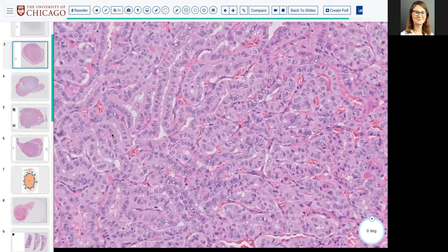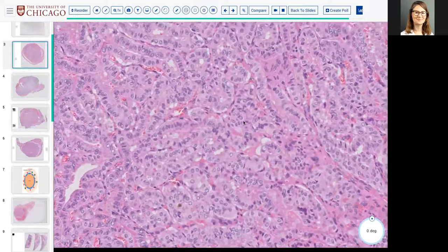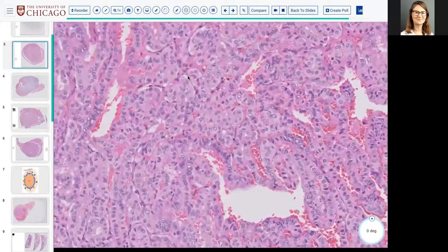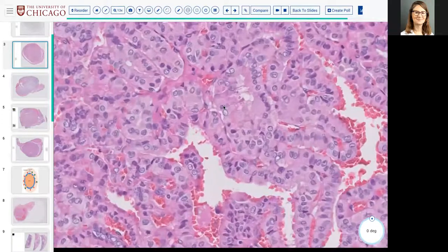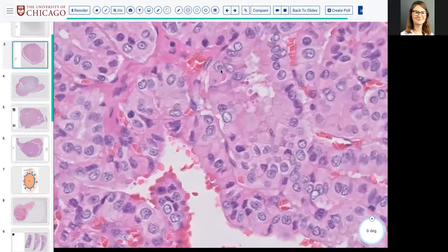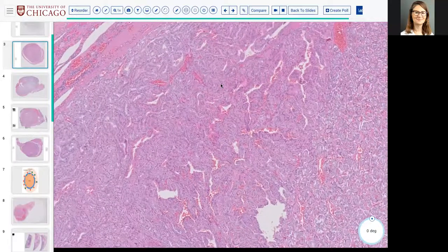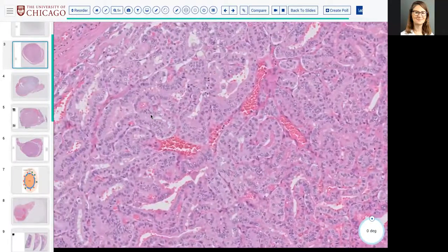There's a papilla right there, and potentially some intranuclear pseudo-inclusions, but I'm not going to go searching for them. You'll be able to do that when I give you the slides. No, maybe there's like the start of one right there. I see. So this was confirmed to be positive with genetics, with sequencing. So this is in fact BRAF V600E mutated.